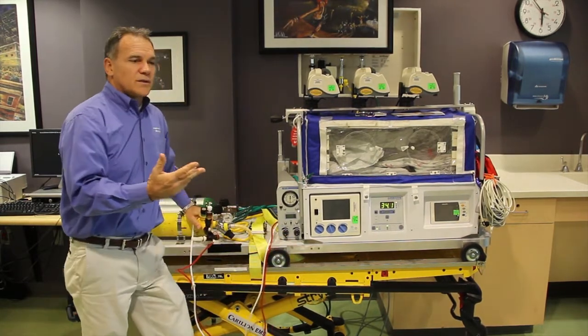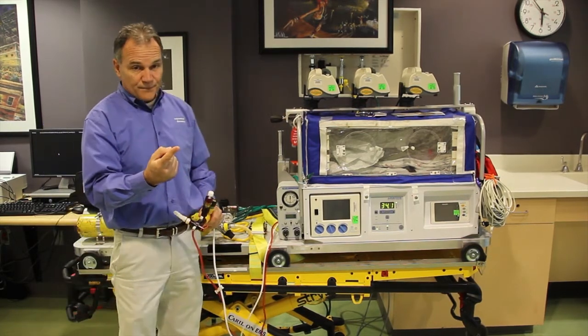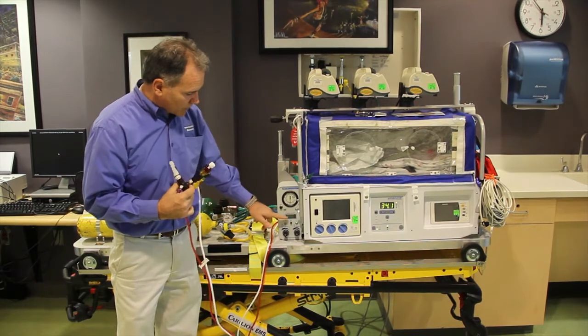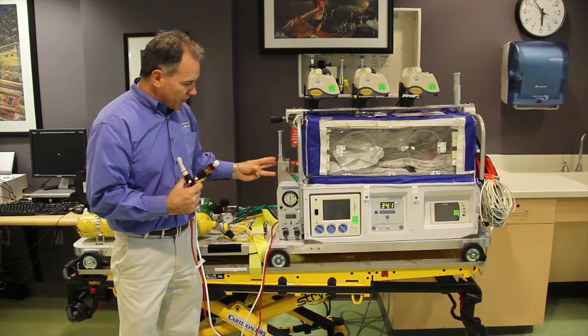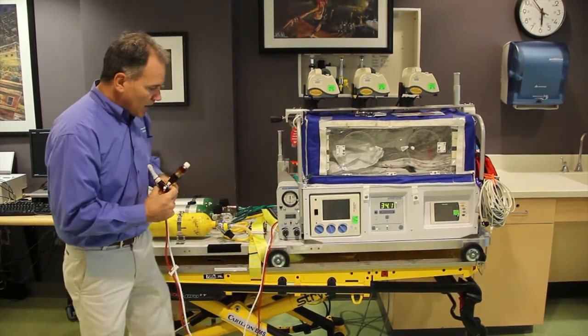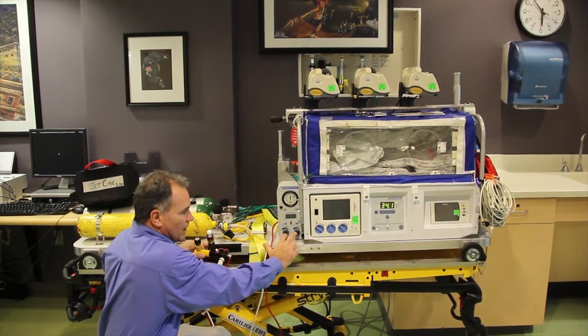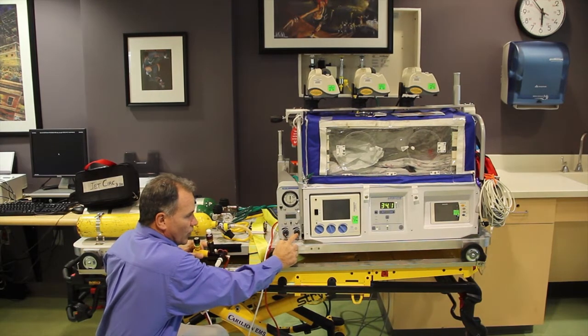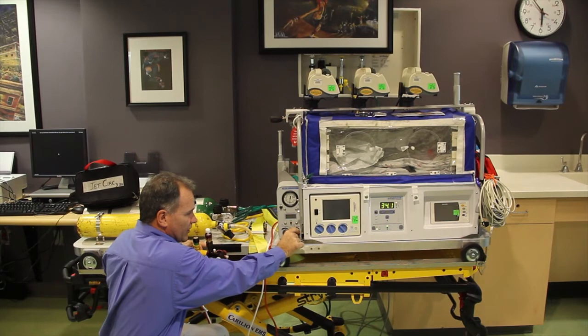The way that the TXP works is fairly simple. There are actually three things that we do when we set up a patient on high frequency: we'll set the frequency right here, then we'll set the mean airway pressure, and then the third thing we'll do is set the amplitude based on chest wiggle. The TXP has two knobs down below, and these are the only two knobs on the ventilator. One says amplitude, which is like creating tidal volume.